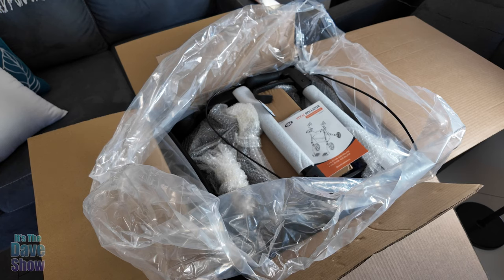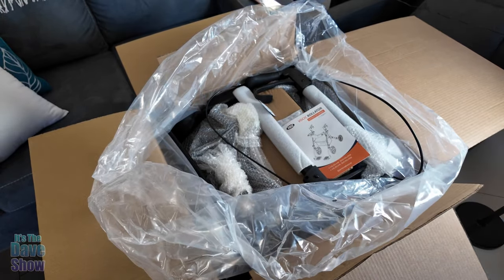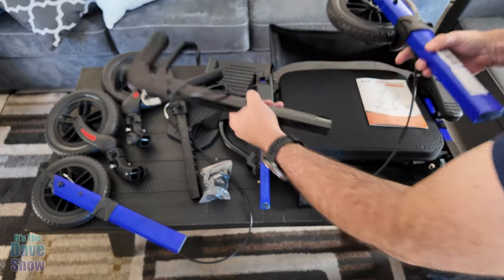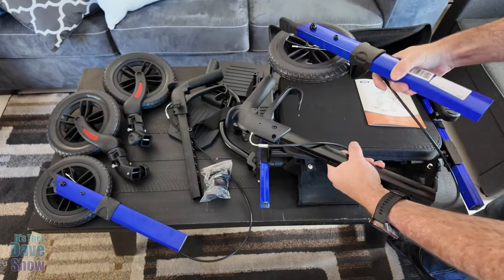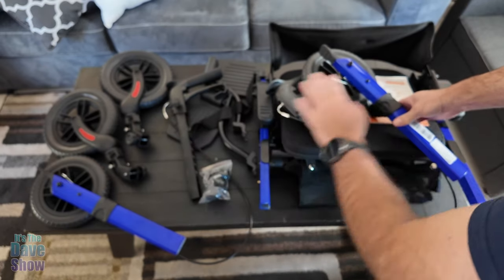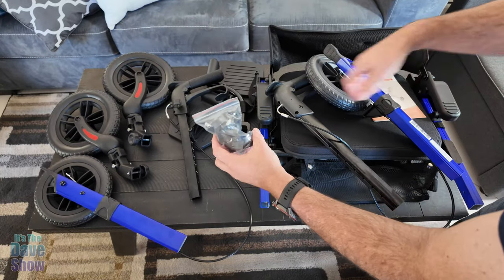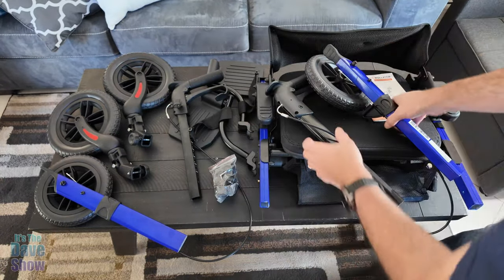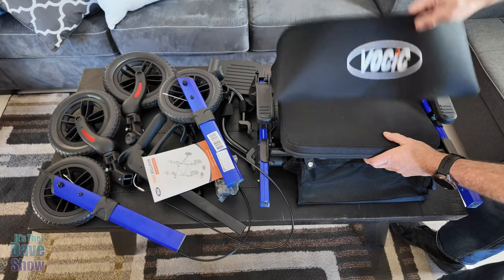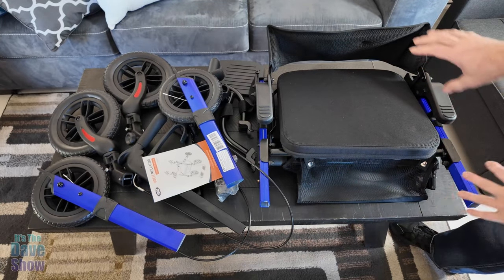Here's everything that comes in the package. You'll get your instruction manual, two handle arms with a wheel each, two front wheels, two foot holders, a package of small hardware parts that screw everything together, and your seat — which has a foldable, reversible back with netting. It's very well packed. Once I get it all put together, I'll show you more details of each compartment.